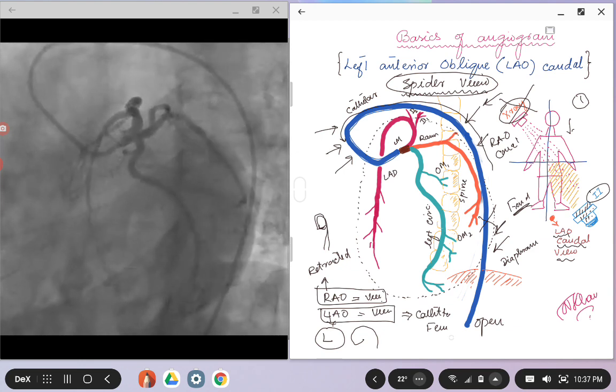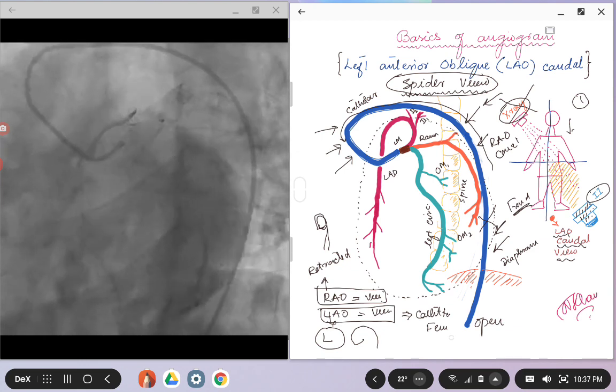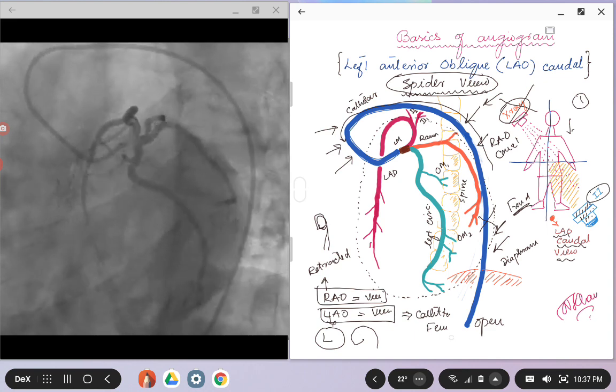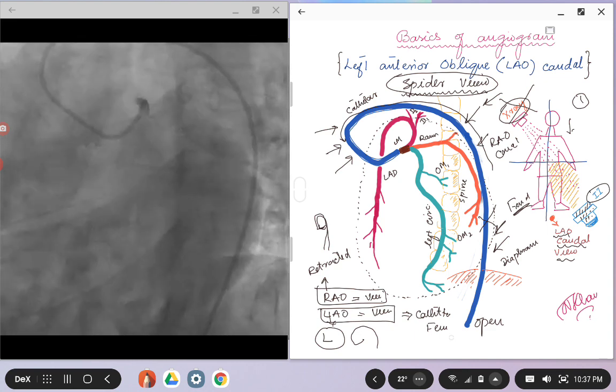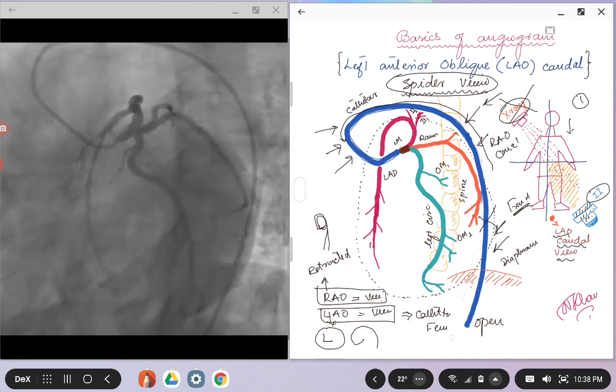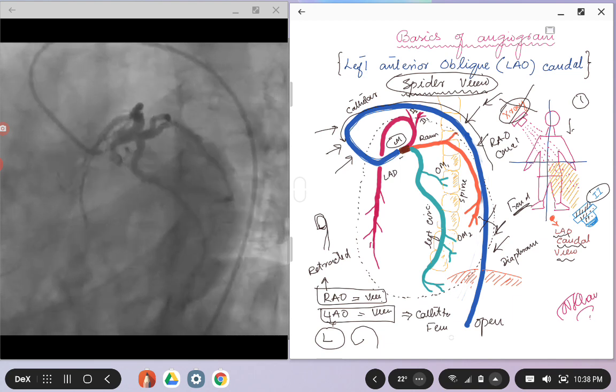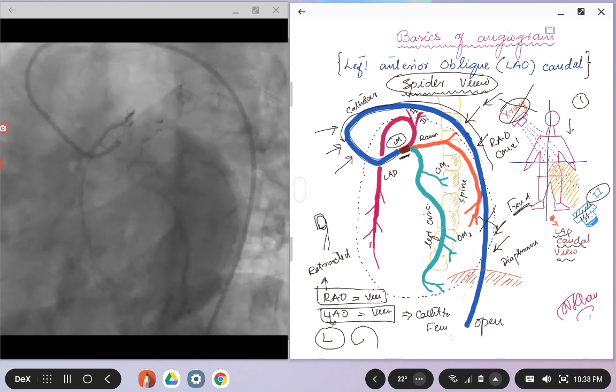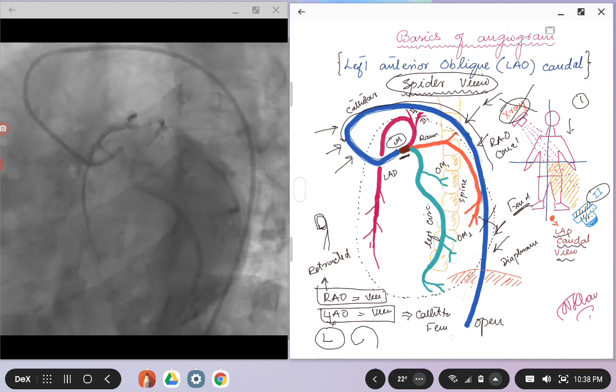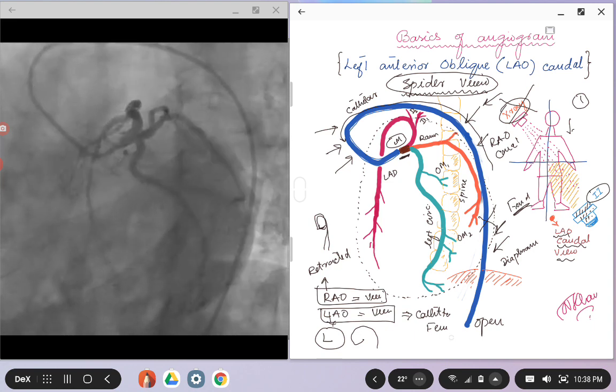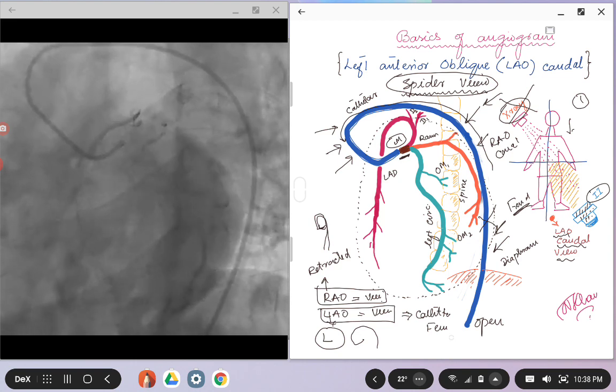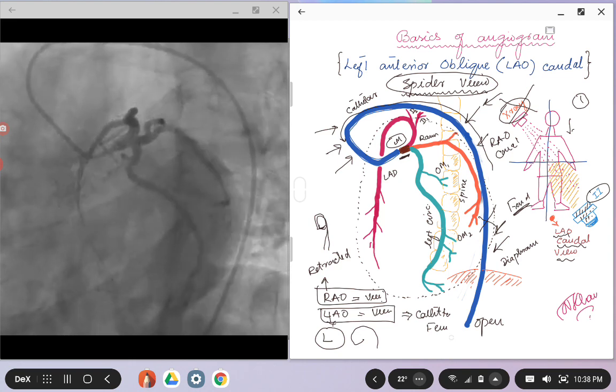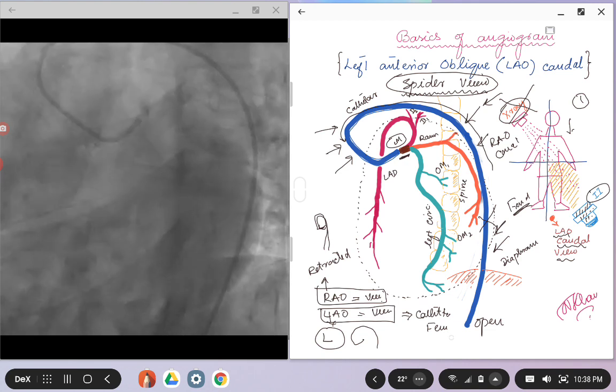So far this was for the catheter. Now we move on to the individual coronary arteries. In previous talk we talked about that this view is very good for looking at the left main, so if you look here, you can see the left main very clearly. And you can see in the cine loop on the left that you can nicely see the left main, even the ostium of the left main where you can see the dye which is going back into the aortic cusp.